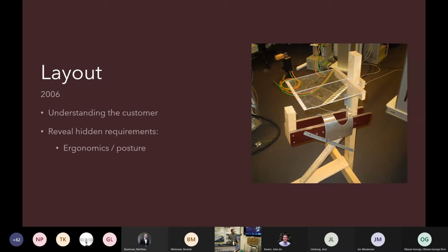You see a glass plate on top. That is where I had envisioned that the dentist would see their screen, and they would sit on the left side, and you see a sort of mask in the shape of a hat. We wanted to see where you sit behind the simulator. There was no such simulator, so we had to ask people what they had in mind, what they thought about. So this was the simple mock-up to see: are we on the same page?